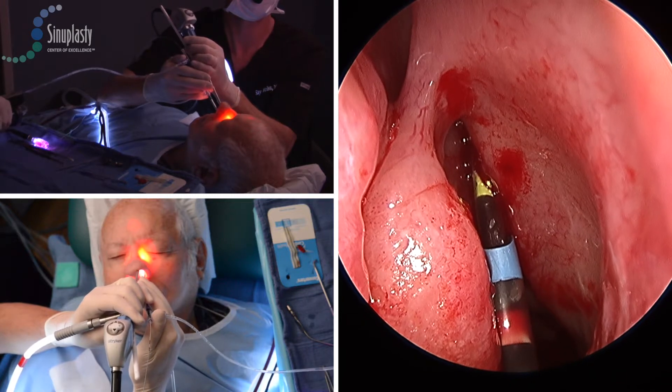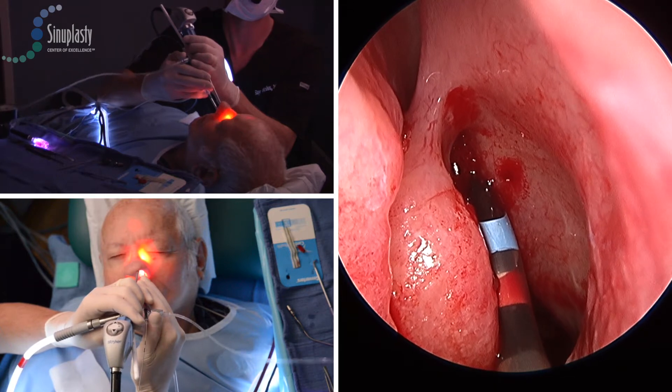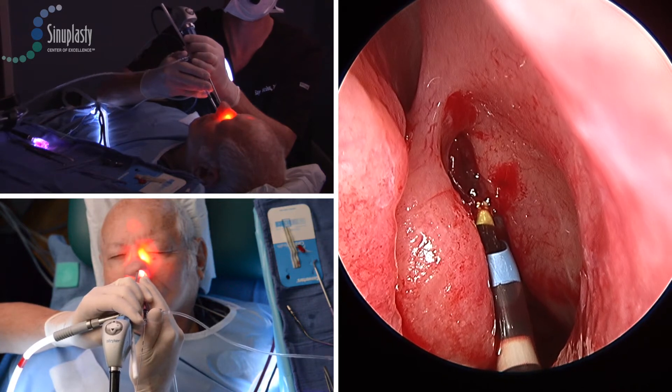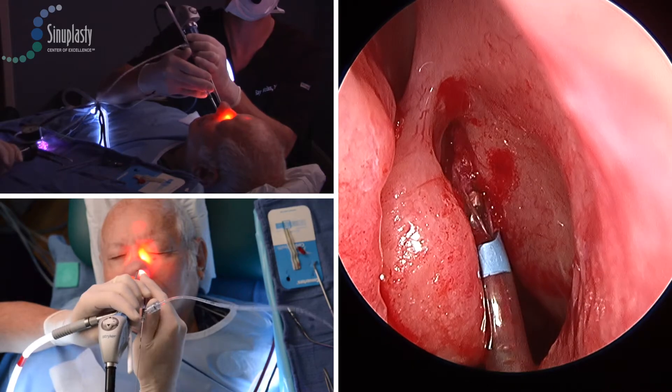We can determine how far to pull back the balloon by looking at the markers on the balloon as they show up endoscopically, and you can see that the patient has tolerated each of these dilations well. After the last dilation has been completed, the balloon catheter is removed.